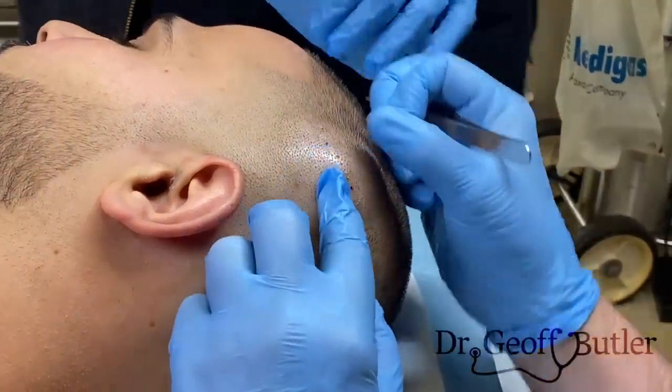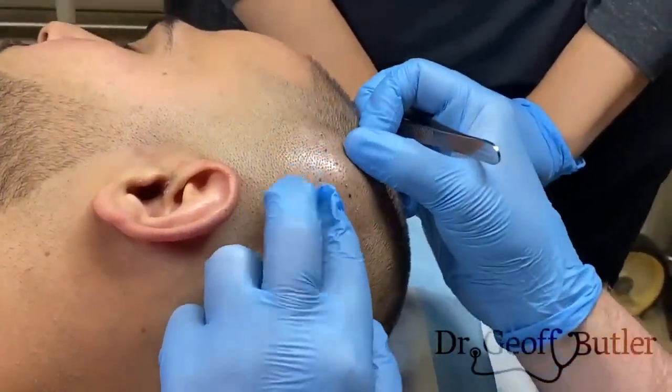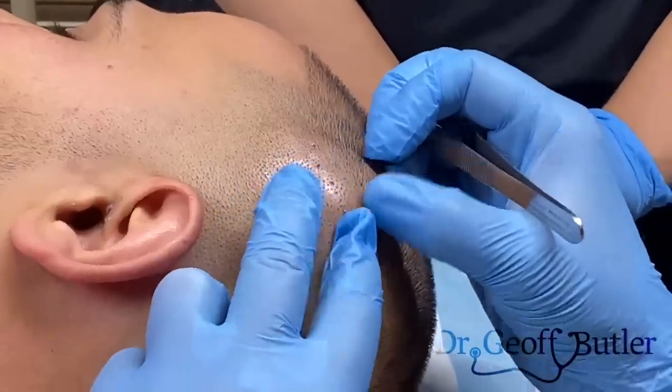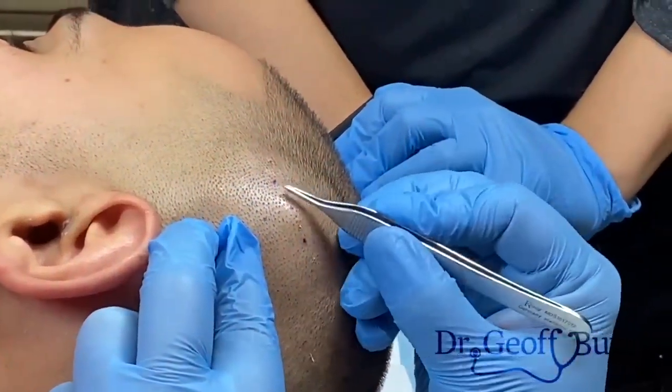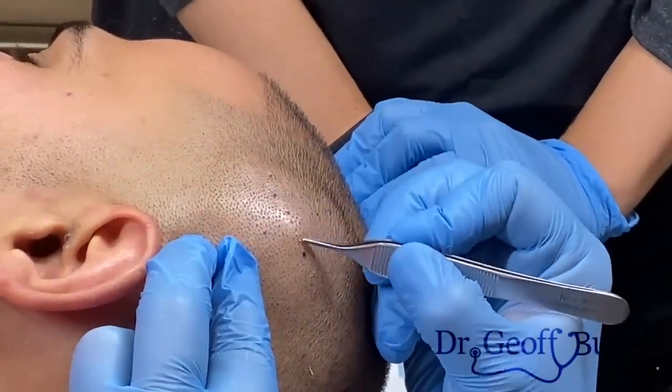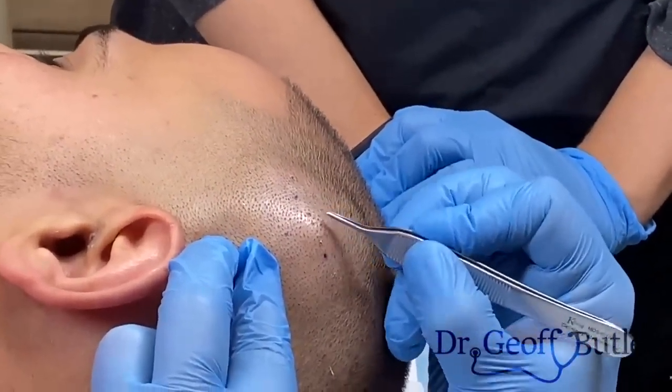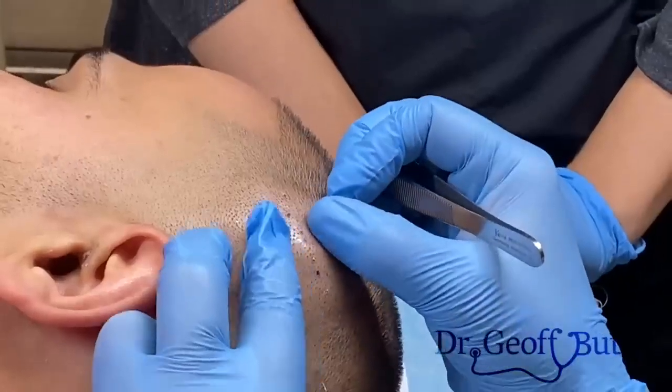So this patient's coming in for removal of a mobile lesion on the left side of his scalp, around the temple area. I'm working with Dr. Jane again today. I was going to have her do this procedure, but this one is a little bit wider. It looks like it's maybe a bit of a calcified cyst, or we sometimes call it a galeocyst, or you can have galeolipomas too. And the question becomes, which one of those are we dealing with?